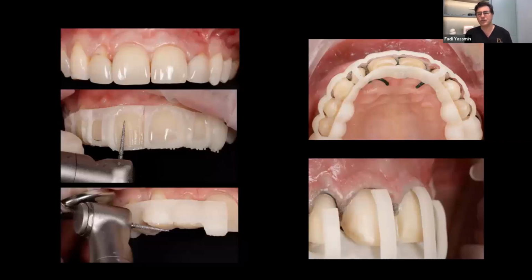To be able to print would be amazing, not only because milling is laborious, it's one at a time and it's a whole heap, but to be able to print all the crowns you're going to be using in one go, design, print, put in, whether we temporarily cement or so forth, that's a game changer. That's a total game changer.